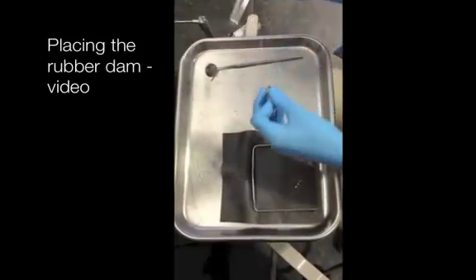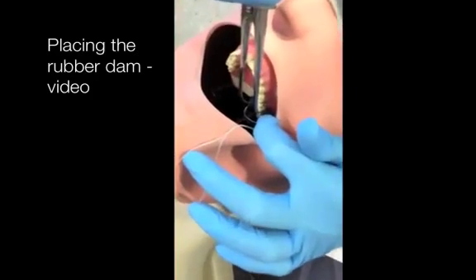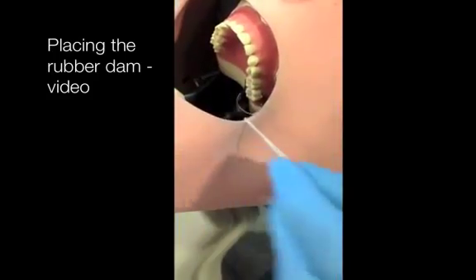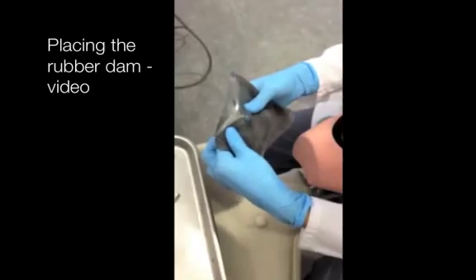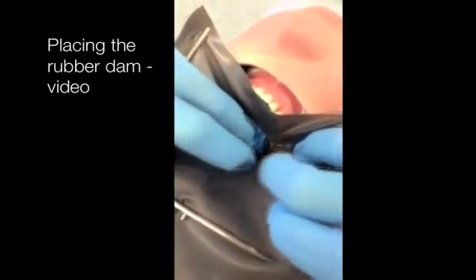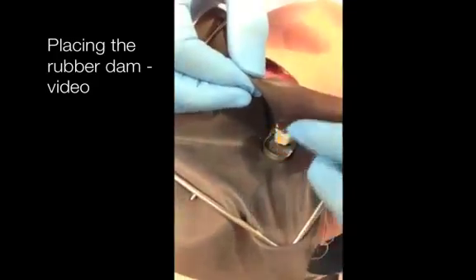Here's a video of placing the rubber dam on a dental patient. We want to place the clamp first and check stability, and also check for a thumbs up confirming a nice tight hug but no pinching. You'll see I'm using a 26N for a fully erupted permanent molar and I keep my finger on the clamp to make sure I have good stability and the clamp doesn't pop off. Check stability — stability good. Now go with your rubber dam. Notice that the dam is already on the frame, which acts as my cheapest assistant to keep the dam out of the way so I can see well. Stretch the hole for the bow — the first part of the clamp going through is just the bow. After the rubber dam goes over the bow, relax behind the bow to decrease the pressure and prevent the clamp from popping off. Then go with each side of the clamp individually — first buccal, then lingual. Now the clamp is secure and inside the dam.